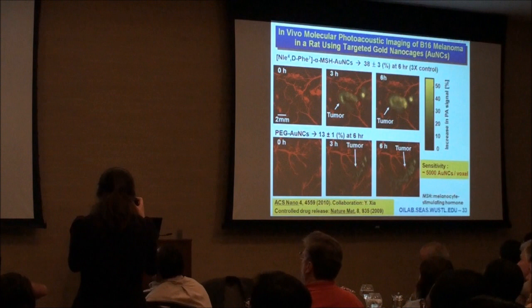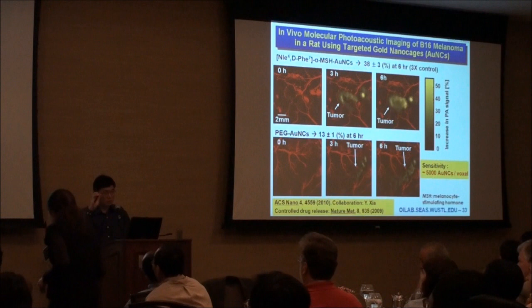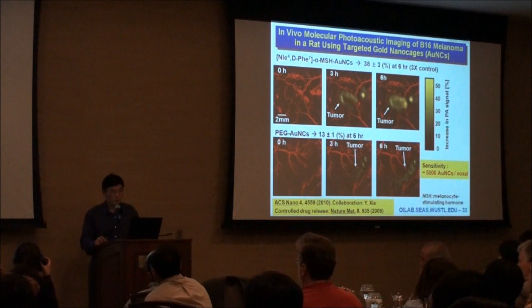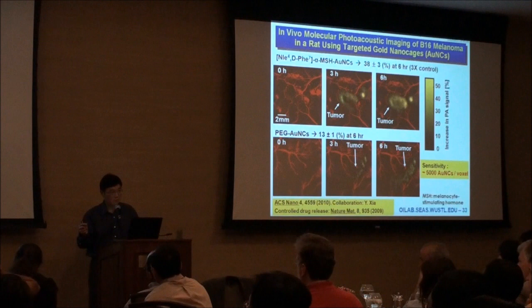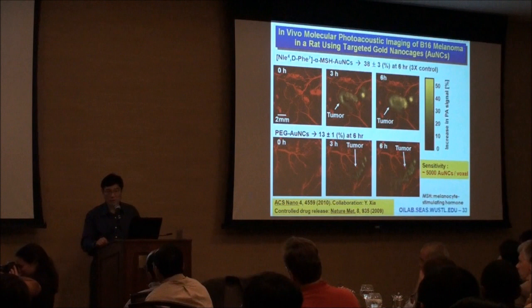Dr. Xia is also interested in loading the nanocages with drug, and wrapping the nanocages with polymers to seal the pores. And when you heat up the nanocages, the polymers will shrink, open up the pores so the drug will release. And when you let the nanocages cool down, the polymers will seal the pores again. So you can come back and do repetitive treatment in a controlled fashion. And we can monitor the treatment process using this technology for imaging.